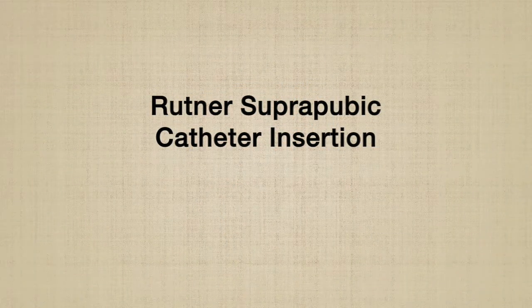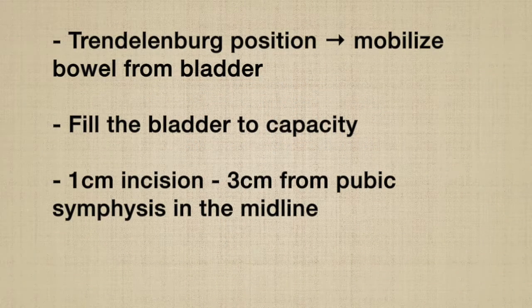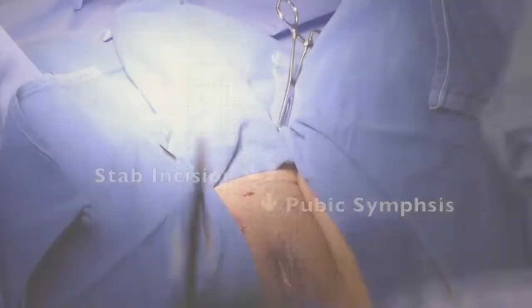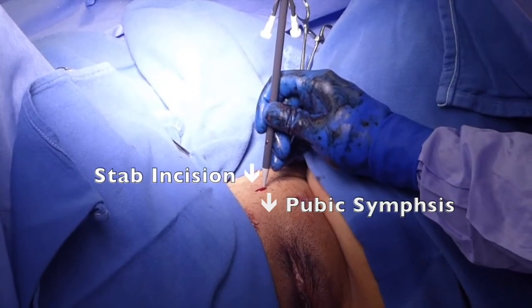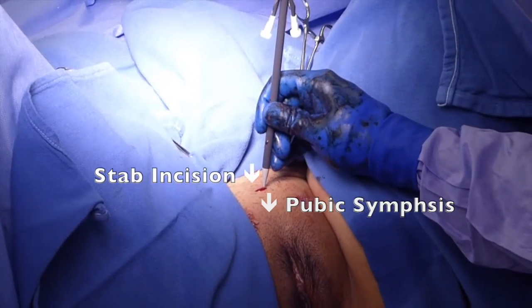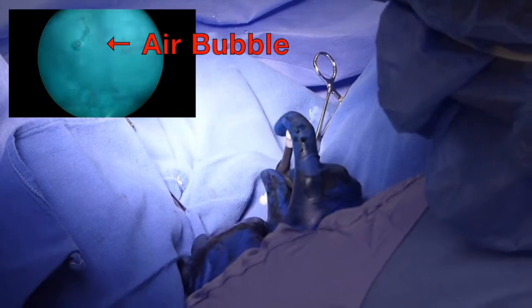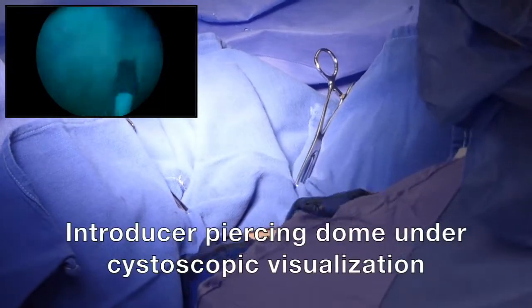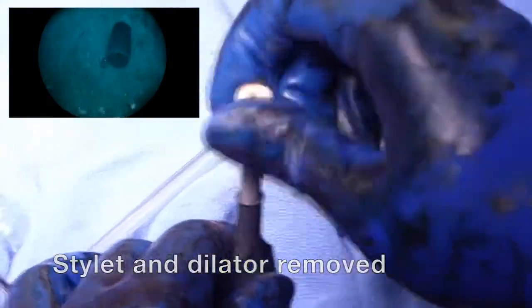Rutner suprapubic catheter insertion: Place the patient in Trendelenburg position to mobilize the bowel away from the bladder. Fill the bladder to capacity. Make a 1 cm stab incision in the midline, approximately 3 cm from the pubic symphysis. Insert the introducer and cystoscope, and aim for the air bubble in the bladder dome. Advance the sheath and remove the sharp stylet and dilator together.